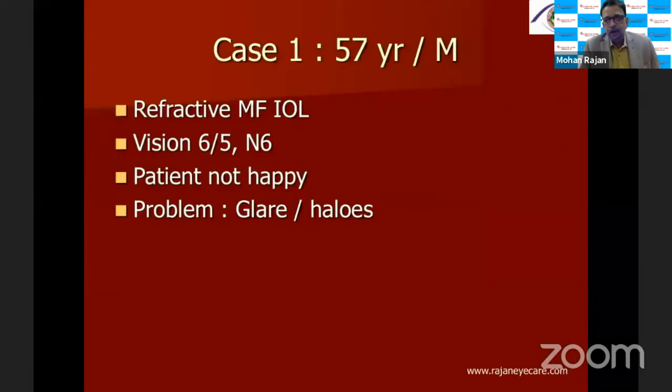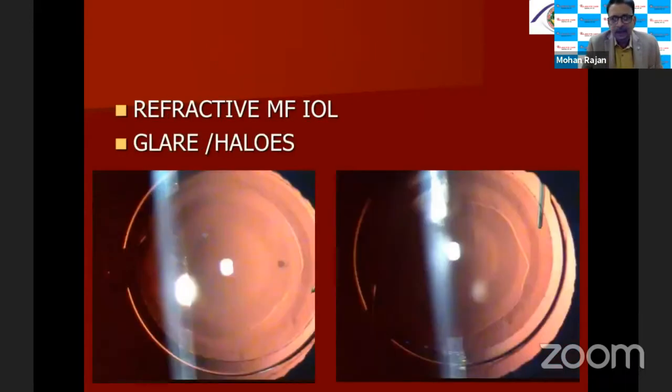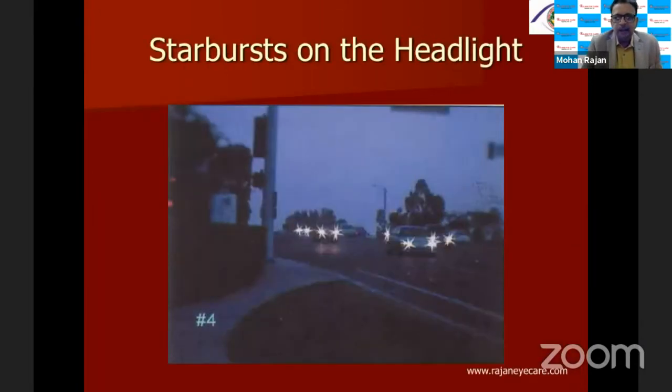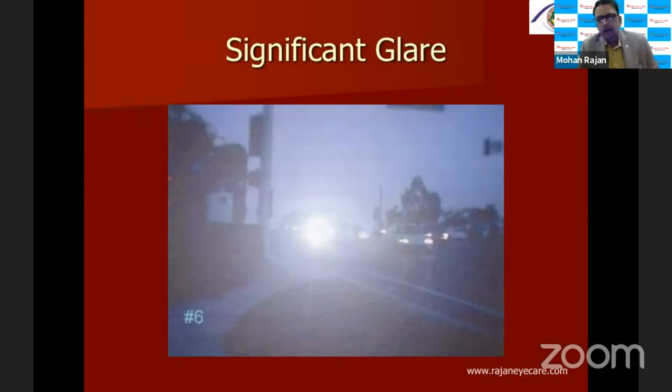I'm going to show you a 57-year-old male, refractive multifocal done a long time back, in 2003, if I'm right. Patient having 6/5 N6 vision, patient not happy. The problem is glare and halos. You can see a perfectly centered lens, beautiful, just like a femtorexis, but the patient is not very happy. The halos and starbursts are on headlights; the photic phenomenon was significant for this patient. The patient was very unhappy.